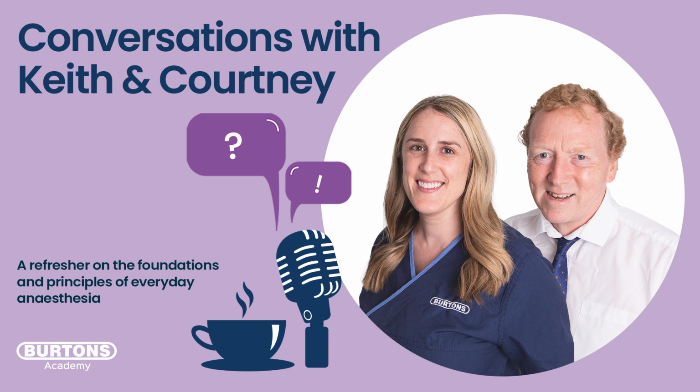It's kind of what I can actually give my patient. And it doesn't have to be a big inbuilt module on your multiparameter, which, like you said, costs about £1,000 to £1,500. You can get them now the size of your closed fist, really. I like to say the size of an iPhone, but that implies it's very skinny. So, it's oxygen analyzers that just go anywhere on the system, the size of your closed fist.